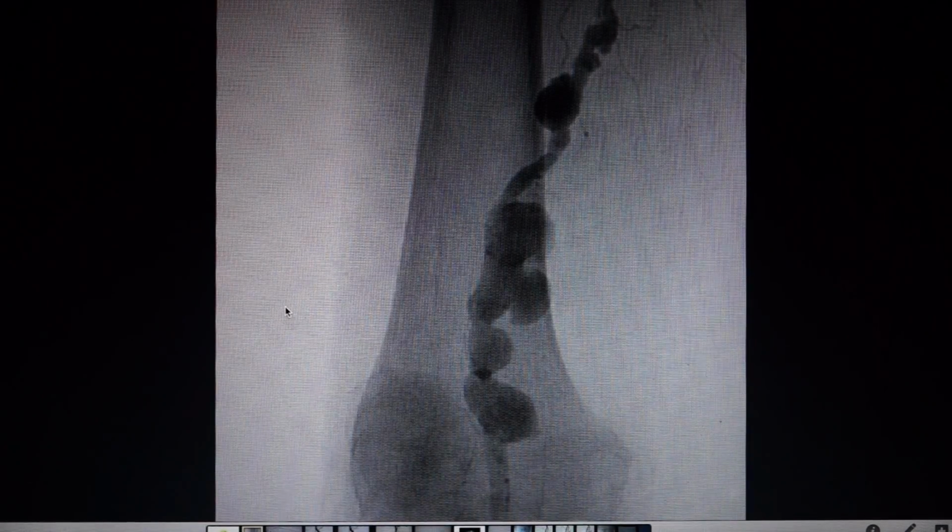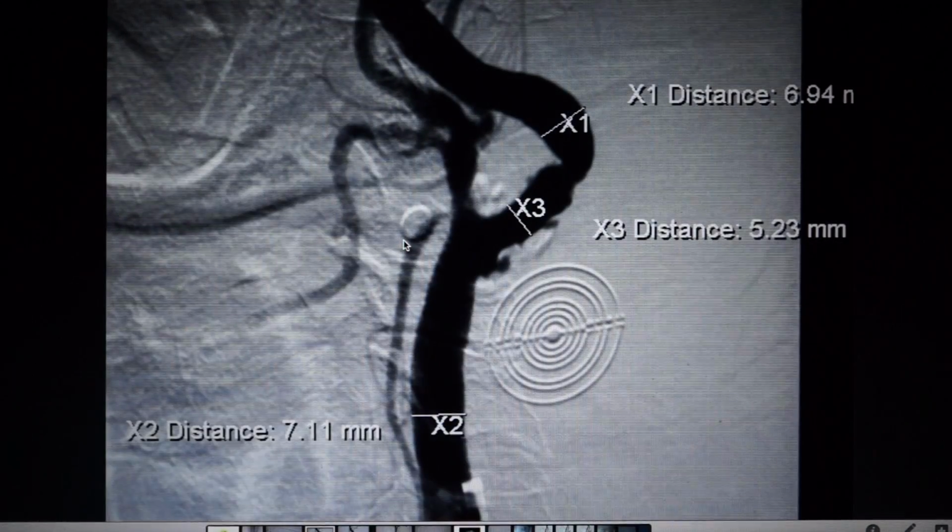Often, the most important part of the vascular intervention is the target vessel diameter. Here's an angiogram of the popliteal artery, and the vessel diameter here where the arrow is not often clearly determined by angiogram alone. Here's an axillary artery thrombosis. The diameter of the axillary artery is not easily measurable. And here is one of the common problems we see in the cath lab or angiographic suite.